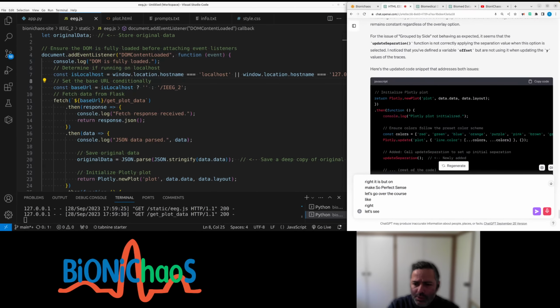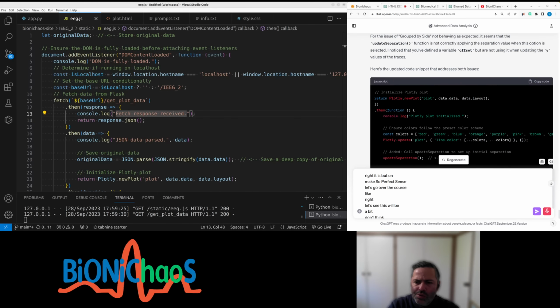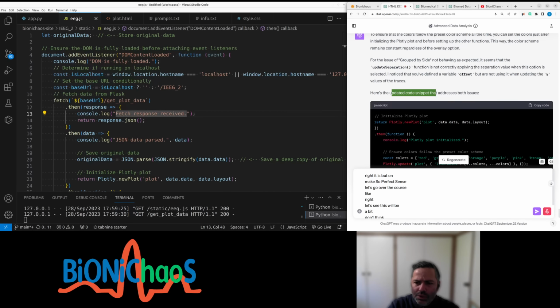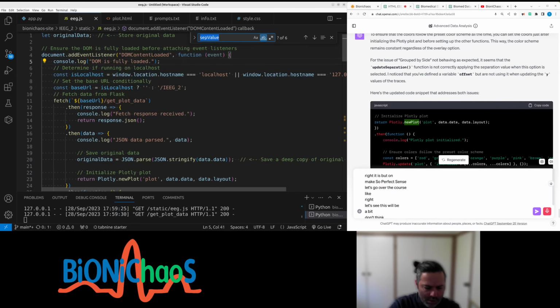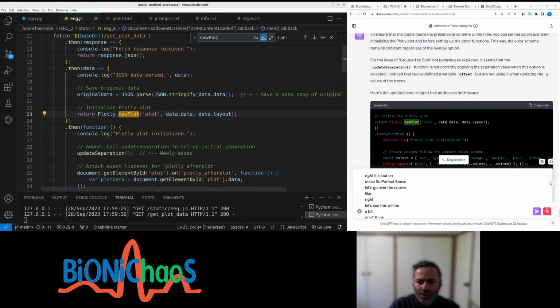Let's see, this will be a bit daunting. What? It's the code snippet. You plot. Do we have it? Return.